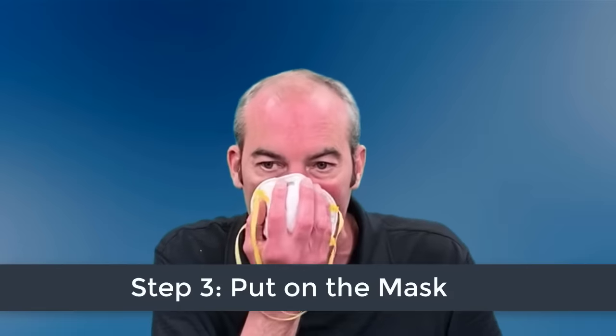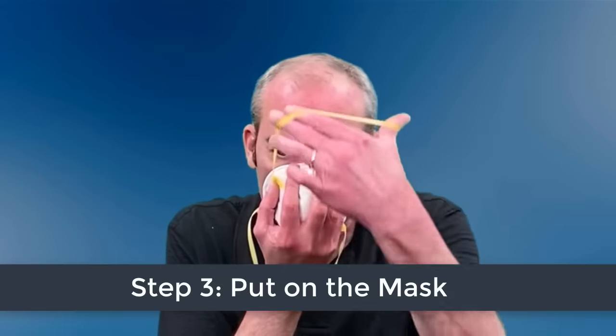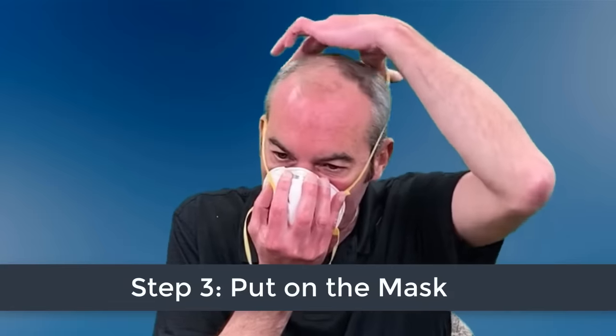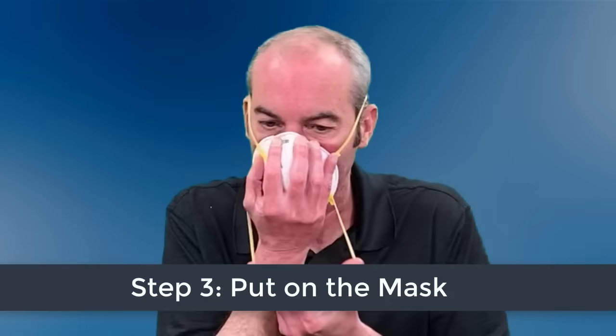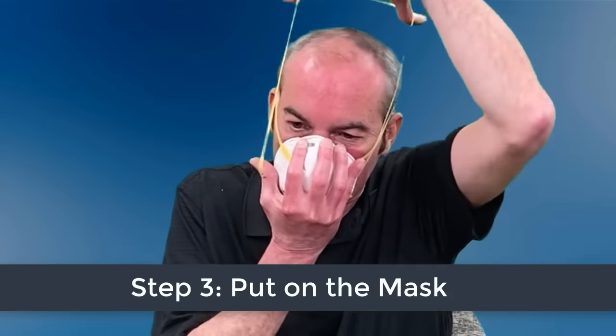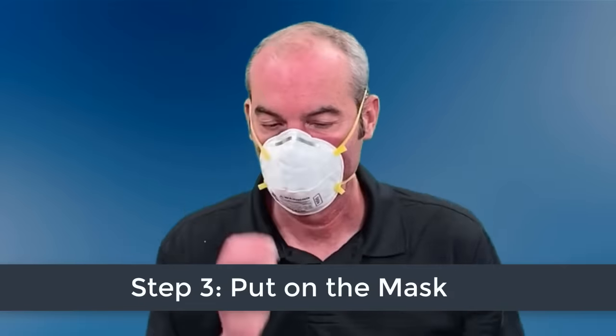After inspecting the mask, cup it in your hand with the nose piece at your fingertips and the straps hanging below your hand. Next, lift the mask under your chin with the nose piece up. The top strap should go over and rest at the top back of your head. If you have a second strap, position the bottom strap around your neck and below your ears. Be sure not to criss-cross the straps.